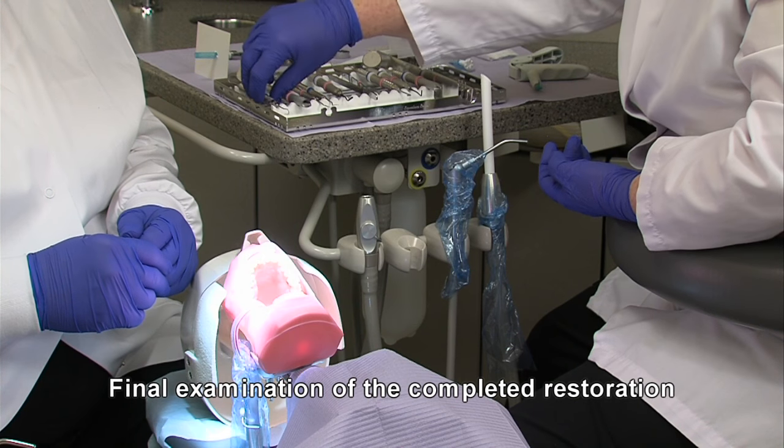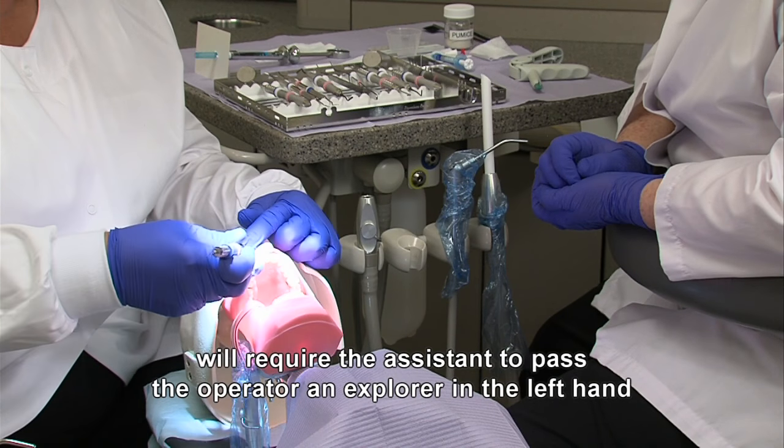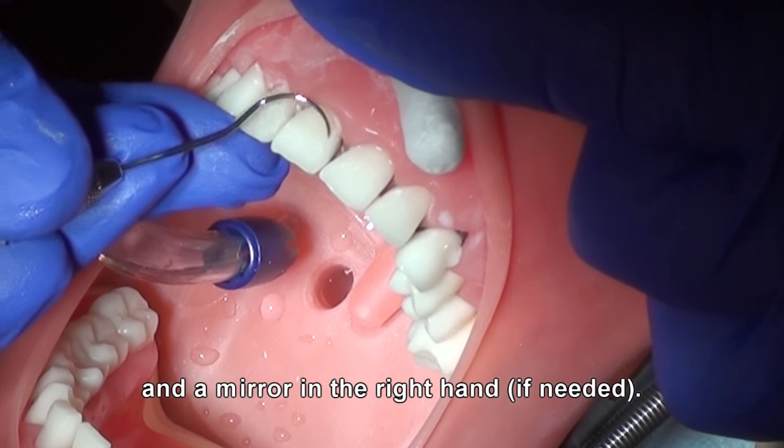Final examination of the completed restoration will require the assistant to pass the operator an explorer in the left hand and a mirror in the right hand if needed.